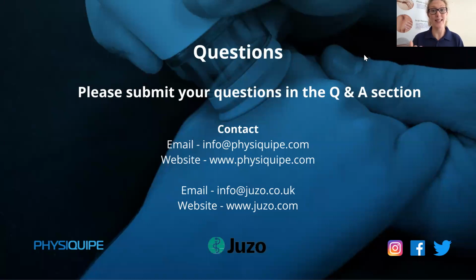And I used the settings on the PowerPro laser low first of all, and started to work up in terms of time. So started with low time and then worked up to 10, 15 minutes, and work through that. Sorry, does that answer the question? No, I think that answers the question.